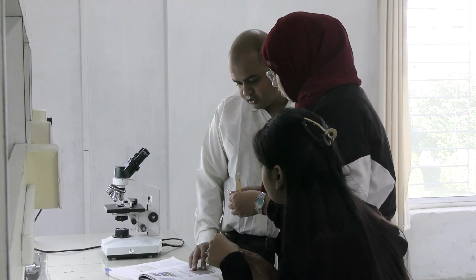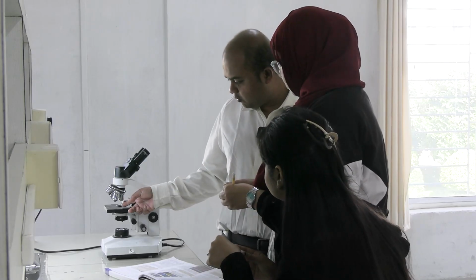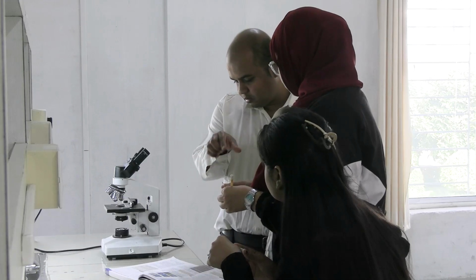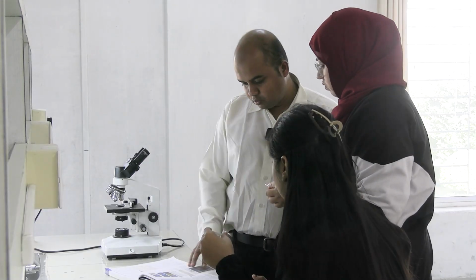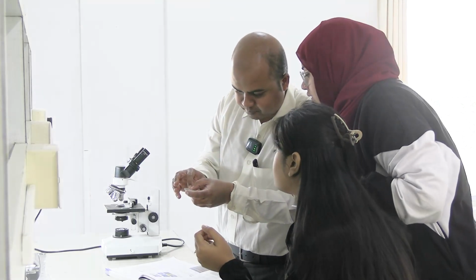First focus it, because after you take the blood in the Neubauer chamber, if you then go to focus it, the blood may spill out. After focusing, this has to be done gently from the sides.